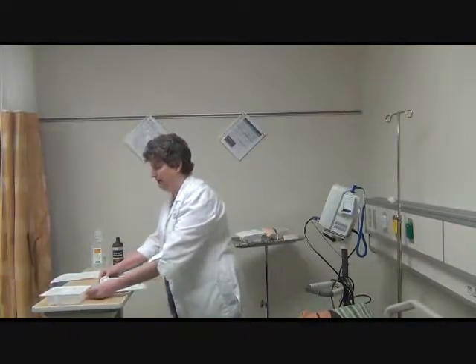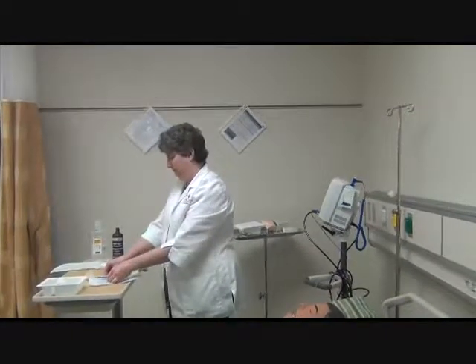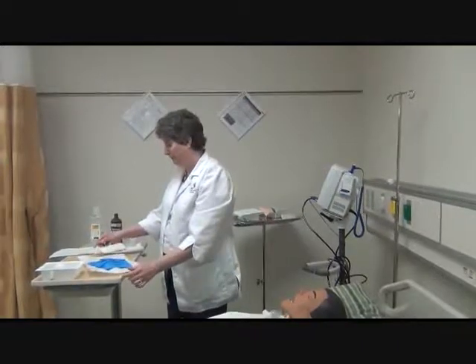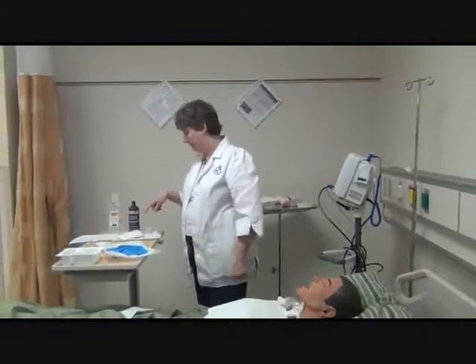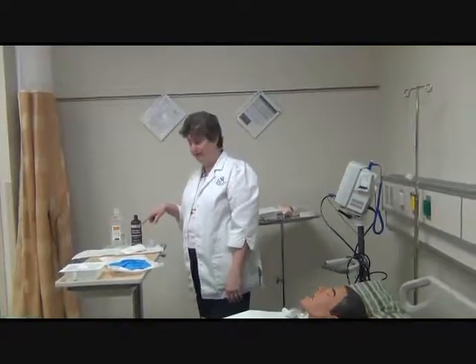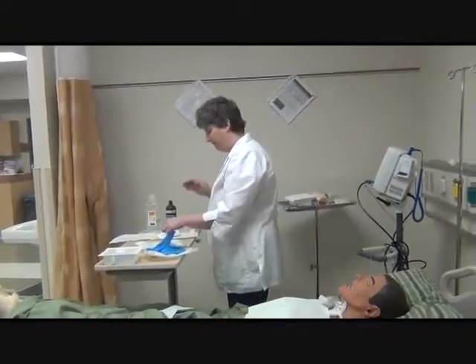And I'm going to open up my gloves. Give it a little snap, and that should hold the gloves open. Now inside your glove kit, you're going to have a suction catheter. You're also going to have a little bowl for your saline irrigation or your rinses. So at this point, I am going to make one hand sterile, and I'm going to put that sterile glove on.